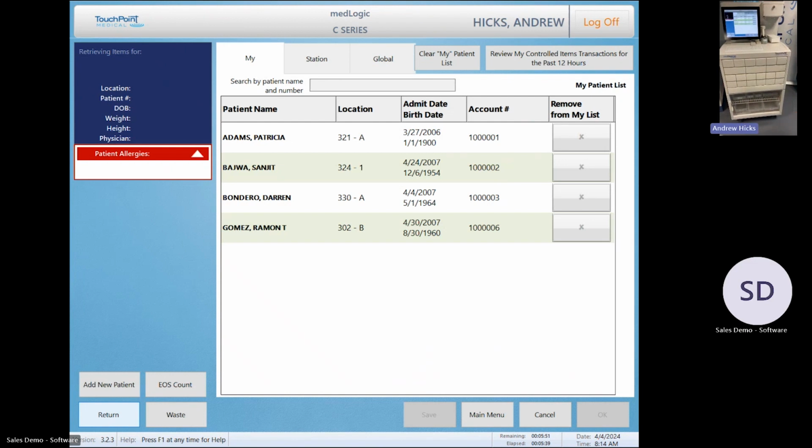There are a couple of different options on the drawers, as well as the three I just showed you. We do have a matrix drawer in this cabinet as well. Not very popular in the United States, more in Europe, but we do have that option. And then you can see down at the bottom, there is some bulk storage. This particular unit is what we call a base 30. So it has drawers in the top for up to 30 of the small 3.5-inch drawers, and again, as well as the bulk storage in the bottom.